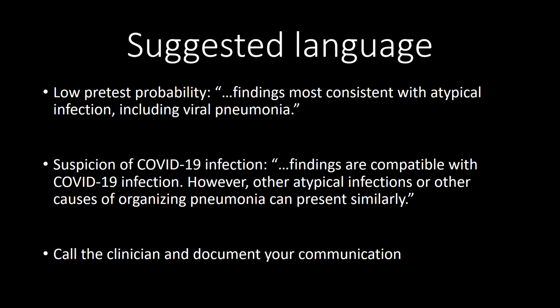And if there is a high suspicion of viral pneumonia or COVID-19 infections, you may consider doing a terminal clean on the CT room. And in some institutions, they may be taking the CT scanner out of service for 1 hour between a patient with suspected COVID-19 infection and a patient with a different clinical problem.